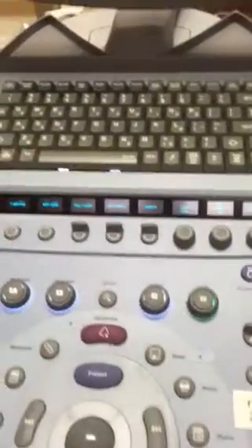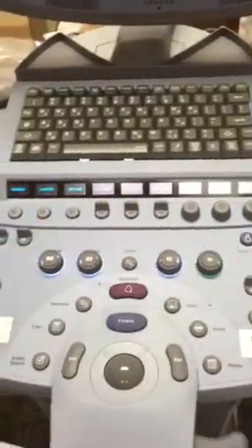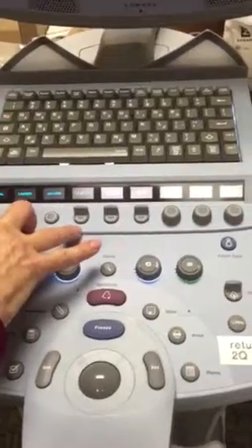On EVLT, can you change it to RFA, or does it have to say EVLT? Yeah, I can change it to that. Sure. RFA, lower extremity arterial, and lower extremity venous. Absolutely. We'll just choose the appropriate one. I've set it up, it should be an LA, which is venous calf.